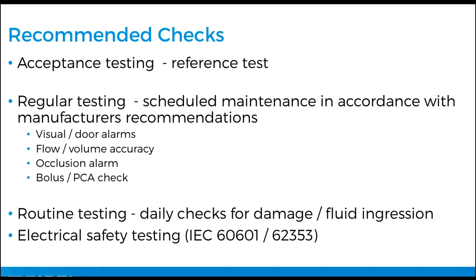So the recommended checks of an infusion device: acceptance testing, so your procurement team have decided to get these devices in, or at least give them some kind of check before they're going to be accepted across your healthcare organization. You're going to have to use some kind of metrology setup to test the validity of the accuracy that the manufacturers claim.